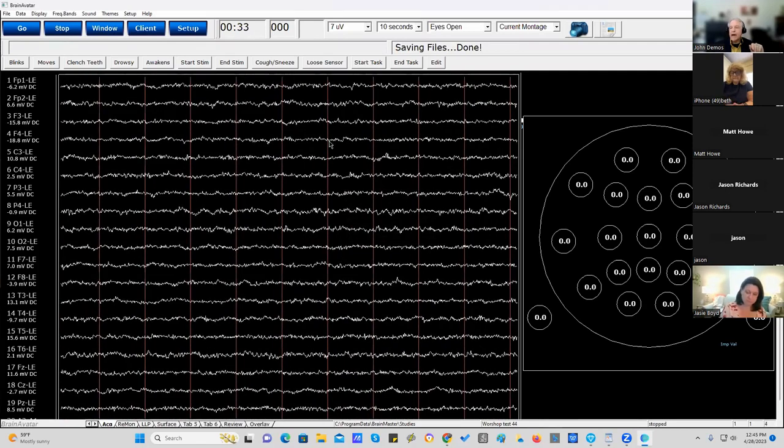Does it have to be exact? No. So how long do we acquire data for? Well, at a minimum, 2 to 3 minutes. Now, that's if the data are fine, because we need at least 1 minute of good data for editing. If the data are poor, we might acquire 5 minutes.